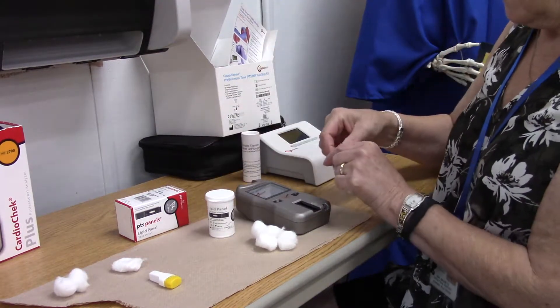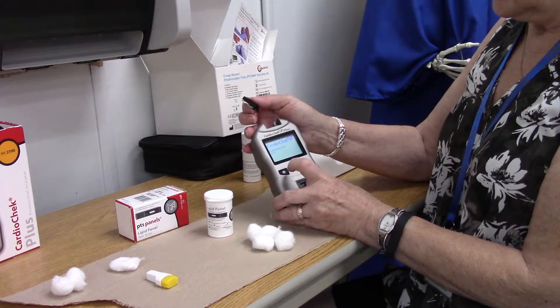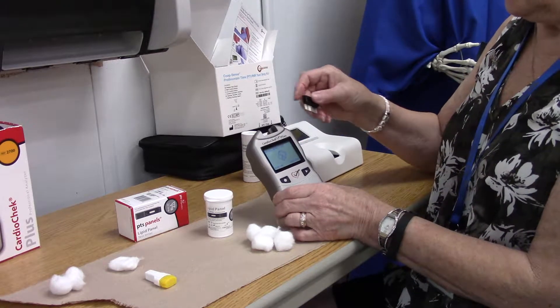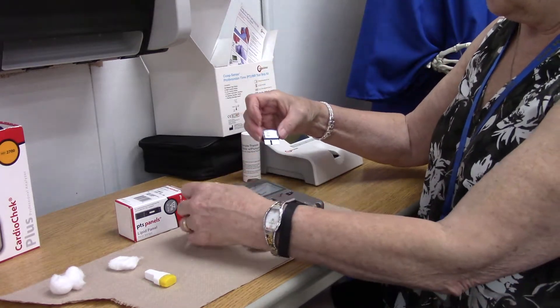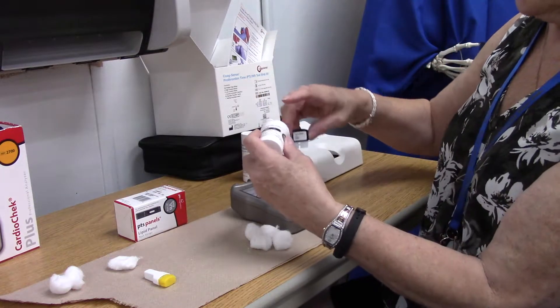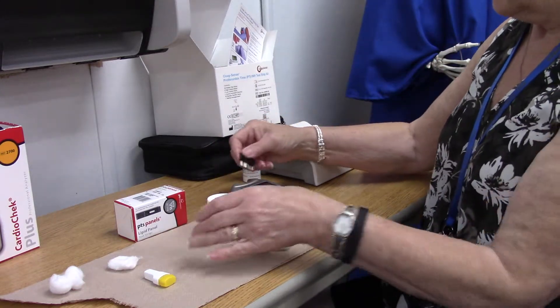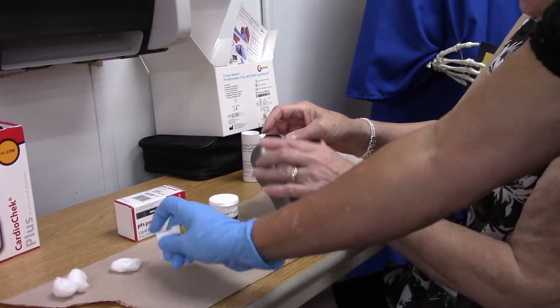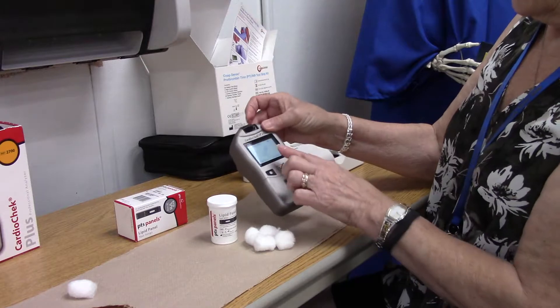Here is your Cardio Check machine. You turn it on and it immediately tells you to install the memo chip. You have to install the chip for it to work. It has lot number P907, which must match the lot number on your test strip — also P907.